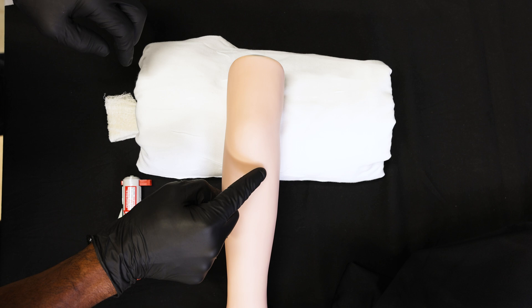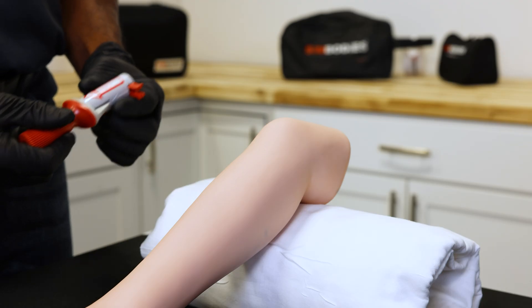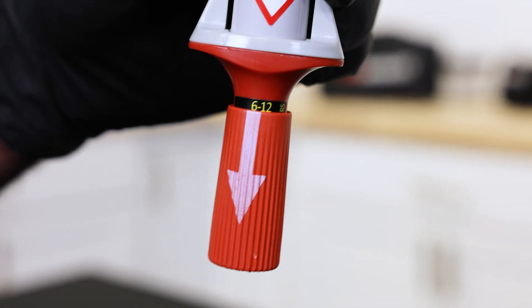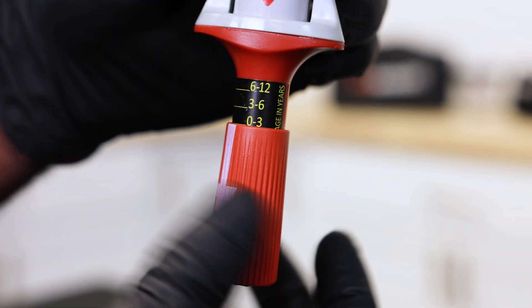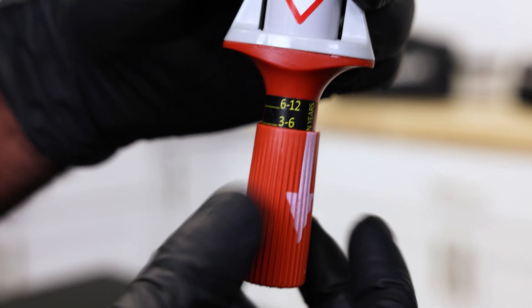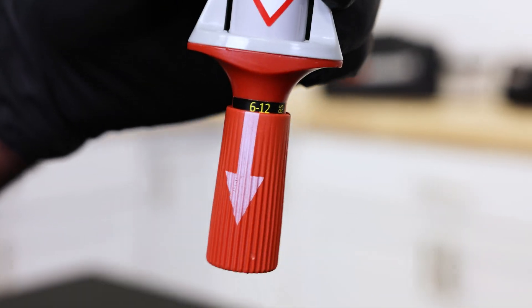To insert the Big P into the tibia for IO access, prep the site according to medical protocol. Notice that the red barrel can be twisted to lower the needle insertion depth to accommodate for the patient's age. Since this patient is 9 years old, we will twist the barrel to the 6 through 12-year-old line.